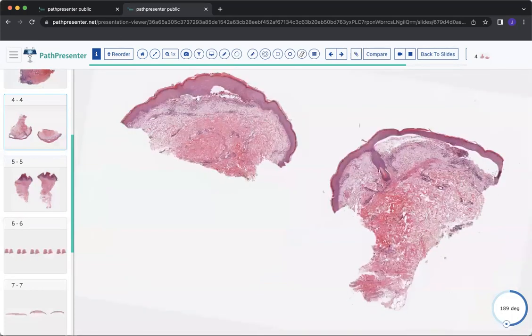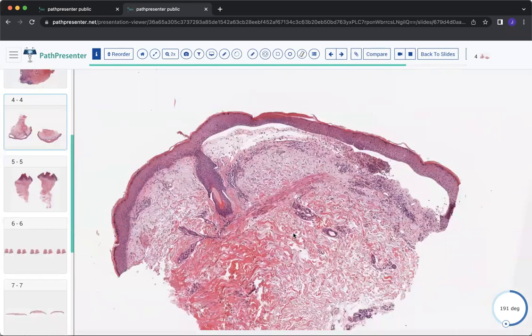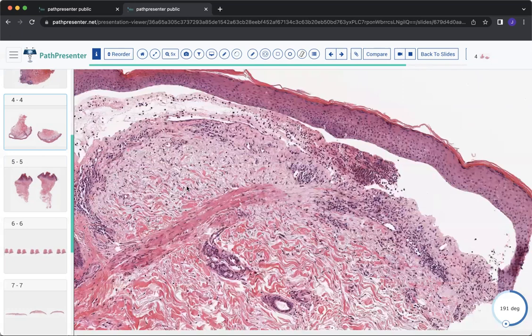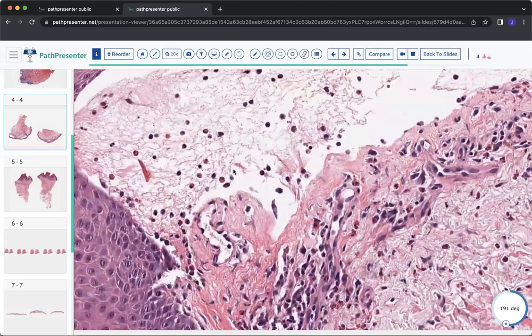All right, number 4, I'll give you a chance to decide what type of defect this is here. You may notice that there seems to be a clean subepidermal bulla here. And when you identify a subepidermal bulla, the next key question is: what is the main component in the blister cavity?